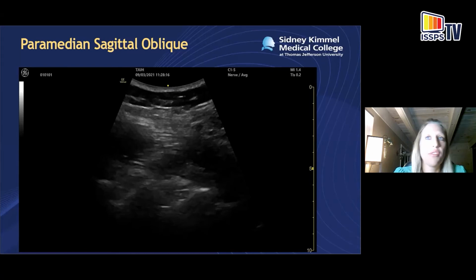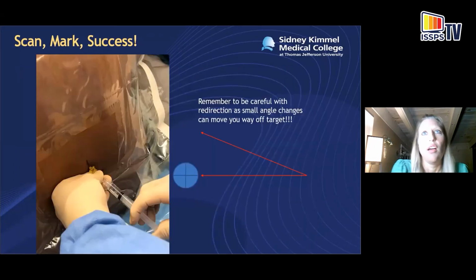I just wanted to really point out that you should remember to adjust your gain and adjust your focus while you're imaging the obese patient, because it can help optimize your images. So here, again, I'm looking at the interspaces. I've actually scanned up from the sacrum to identify the L3-L4 space, and we can see the lamina, the horse's heads, and the posterior complex there at about 7.5 centimeters. So as I like to say, it's pre-scan first, mark, and then success.